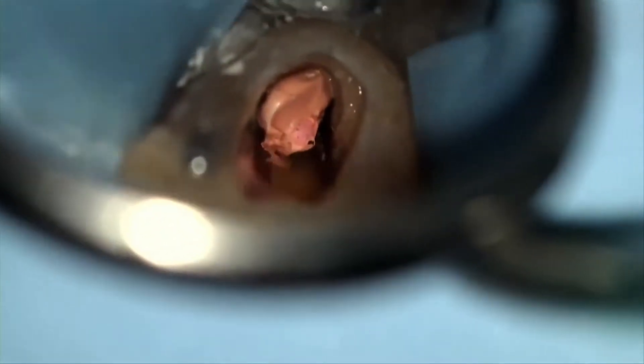But with Thermafil and other carrier-based systems, you have to use a handpiece to remove the carrier, but not so with gutta core. That is something I personally found to be a great advantage of gutta core.